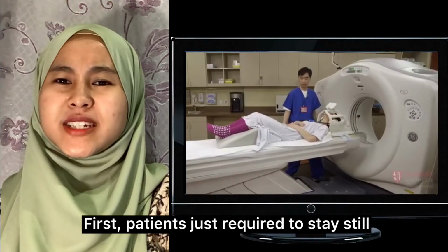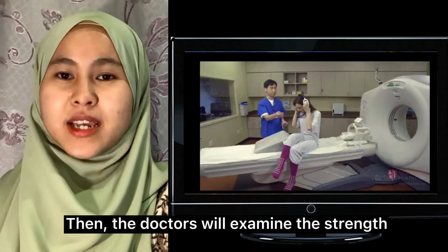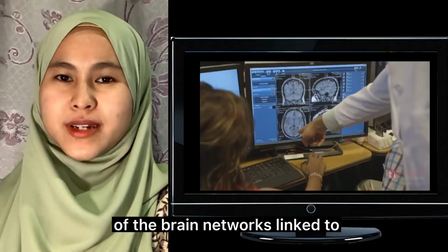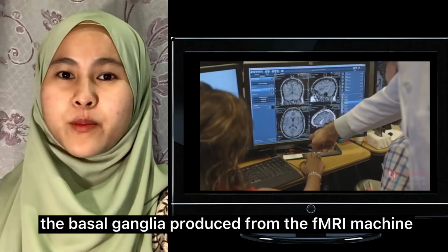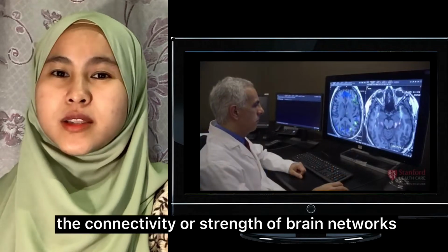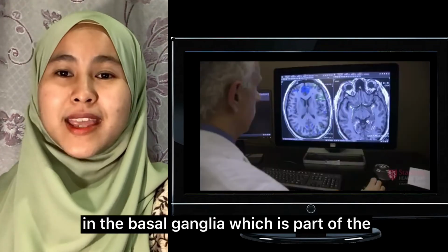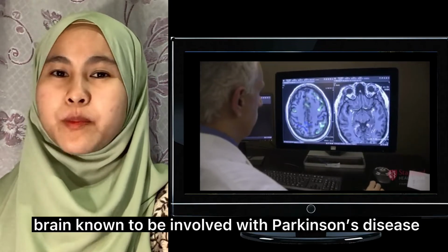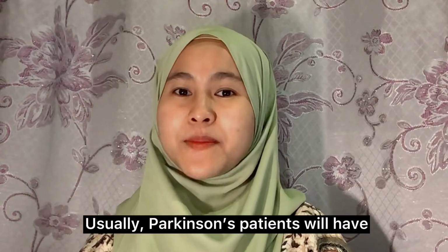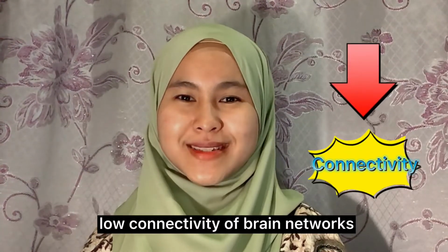First, patients are just required to stay still in the fMRI scanner. Then, the doctors will examine the strength of the brain network linked to the basal ganglia produced from the fMRI machine. Generally, the doctors will look at the connectivity or strength of brain network in the basal ganglia, which is the part of the brain known to be involved in Parkinson's disease. Usually, Parkinson's patients will have a low connectivity of brain networks.